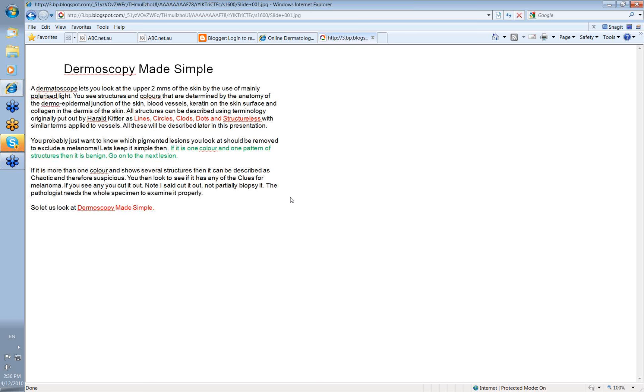Now all the structures you're going to see can be described using terminology originally put up by Harold Kittler. Harold described these structures basically as lines, circles, clods, dots, and structureless. He also used the term pseudopods, which we'll define later. Similar terms can be applied to vessels. So you can have vessels as lines and vessels that are clod-like or circular. All of these will be described later in this presentation.